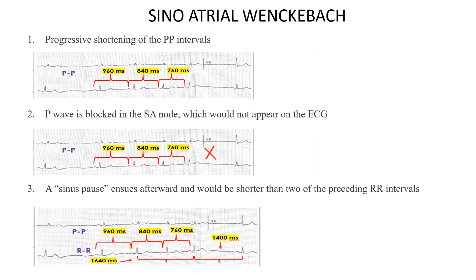Now let's discuss the ECG features of sinoatrial Wenckebach. It must fulfill three criteria. First, there will be a progressive shortening of the PP interval — this is happening here, with PP intervals decreasing from 960ms to 840ms to 760ms. This criterion is met. Second, the P wave is blocked in the sinus node and will not appear on the ECG; the gap here indicates no P wave, and then the P wave reappears. This criterion is also met.